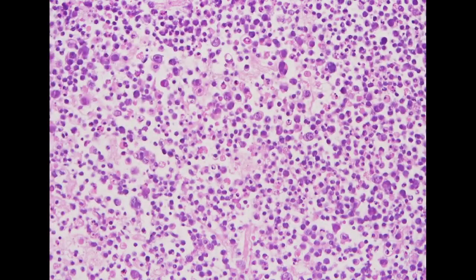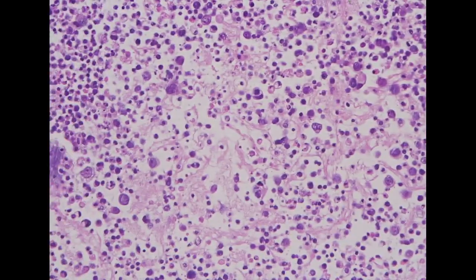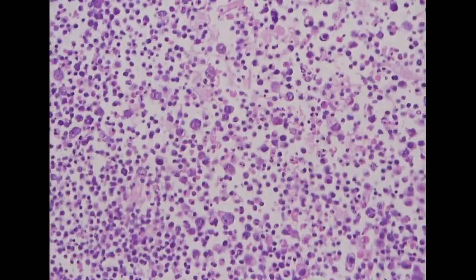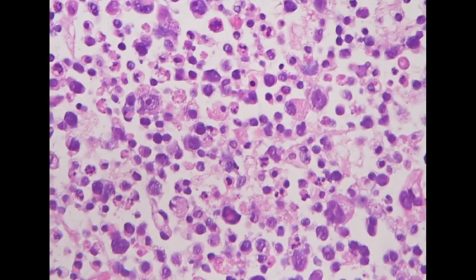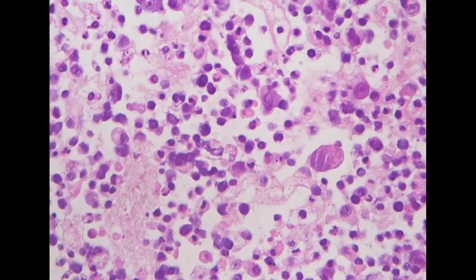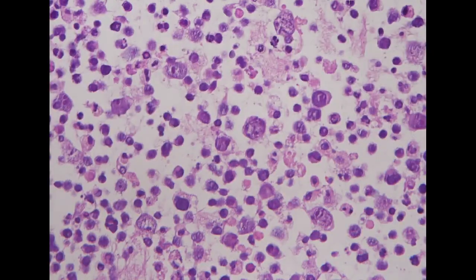Since we have the cell block preparation, I think it is better for us just to confirm that this is of epithelial origin. So our choice of stain would be MOC-31 or Claudin-4. Because it is from pancreas, there is no specific transcription factor marker for this scenario. So we would stain it for MOC-31.